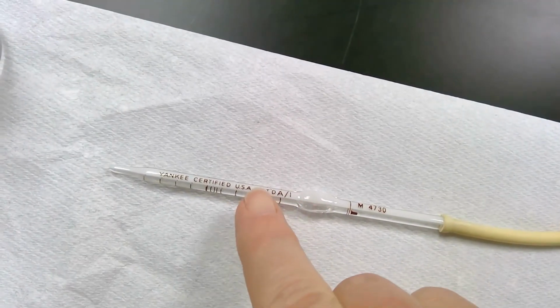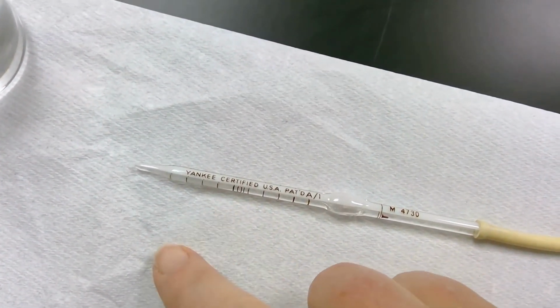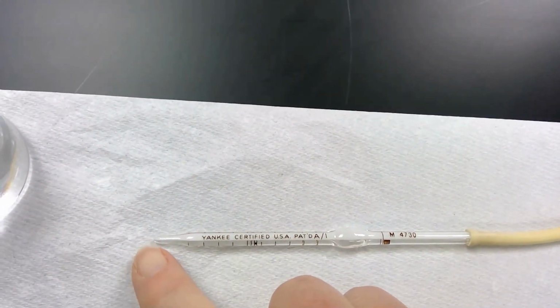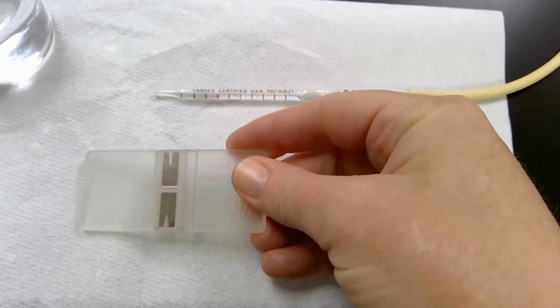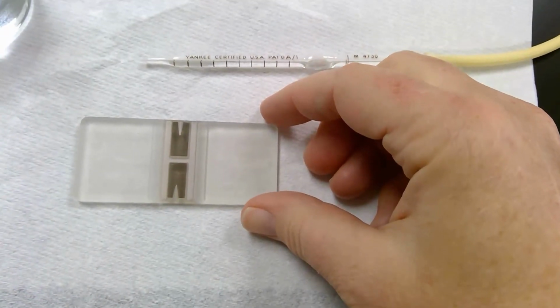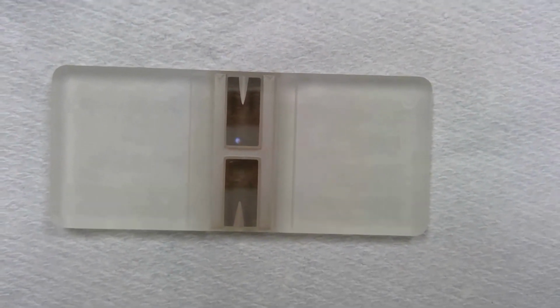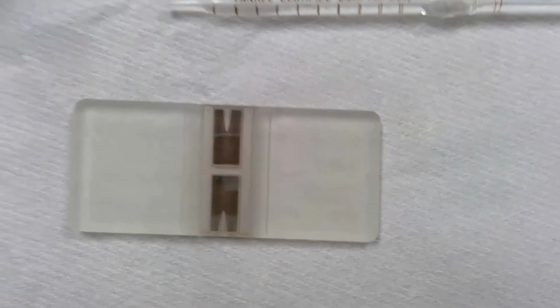Then we have to clear just the plain water that's here. So then you squirt about 5 drops out onto a paper towel. That way, the diluted blood mixture from the chamber is now down at the tip. Once you do that, you're ready to load it into the slide. So this is a special type of slide called a hemocytometer. And you can't see it when you just look at it regular. But on those metal parts in the middle, there is a grid etched in there. And that grid helps us count.